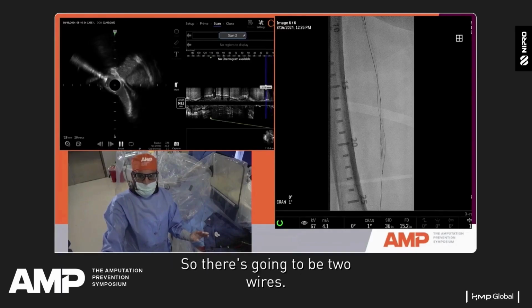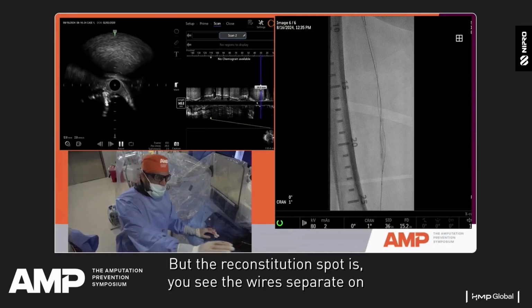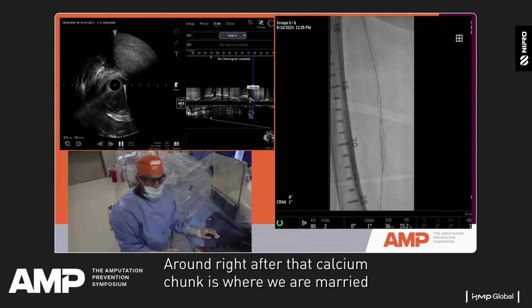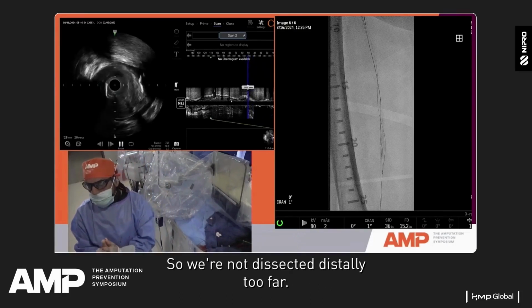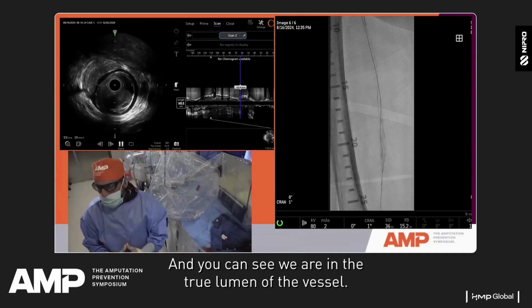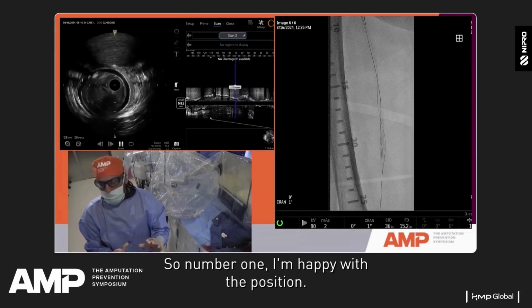All right. So you can see here, basically the reconstitution spot is, you see 2 wires, right? So there's going to be 2 wires. I don't know if this shows it or not, but the reconstitution spot is, you see the wires separate on X-ray around 20, right after that calcium chunk is where we are married distally. So we're not dissected distally too far. And then in the proximal segment, we're completely married together, and you can see we're in the true lumen of the vessel. So number one, I'm happy with the position.